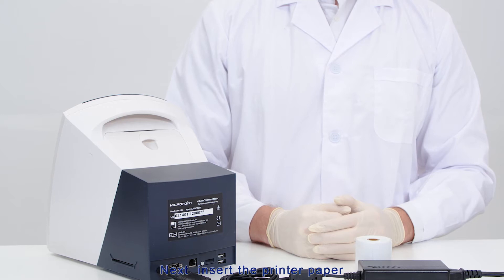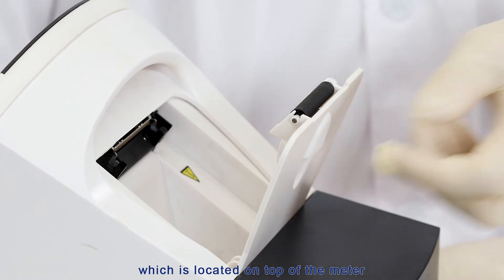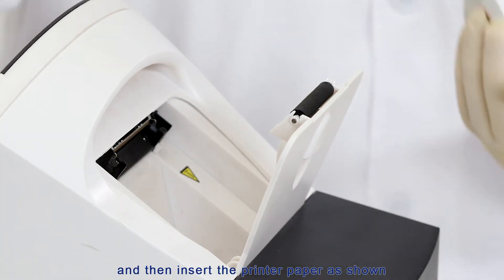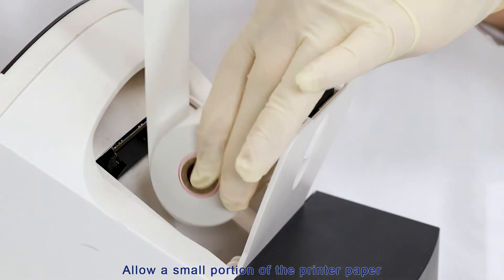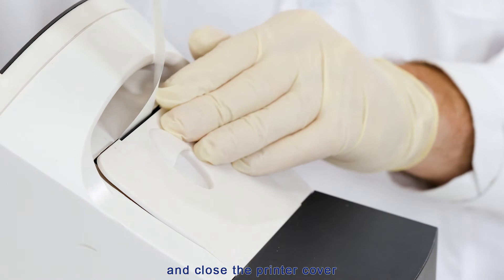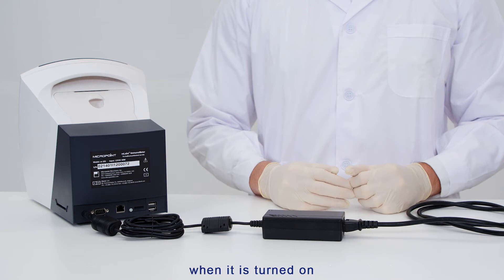Next, insert the printer paper. Pull up and open the cover of the thermal printer, which is located on top of the meter, then insert the printer paper as shown. Allow a small portion of the printer paper to extend outside of the printer paper compartment and close the printer cover. The meter will automatically feed the thermal printer when it is turned on.